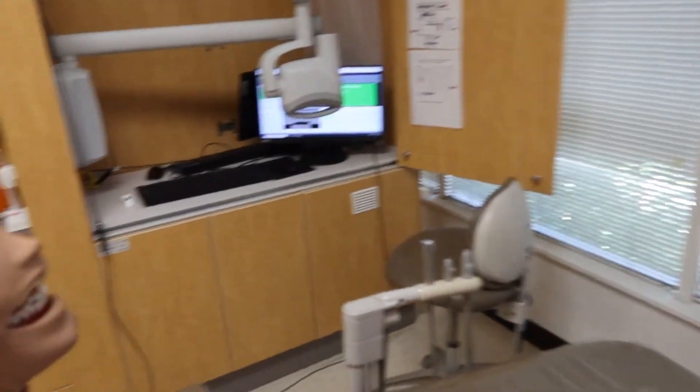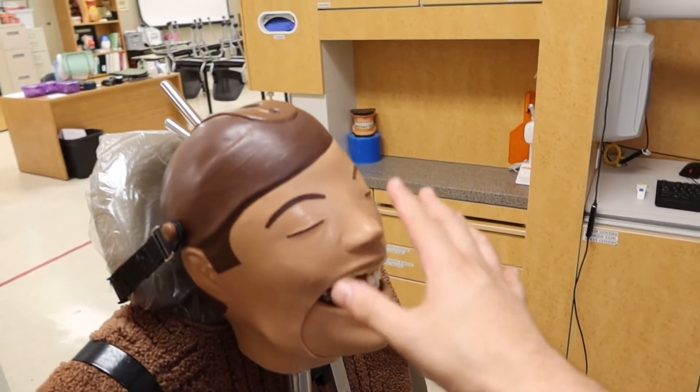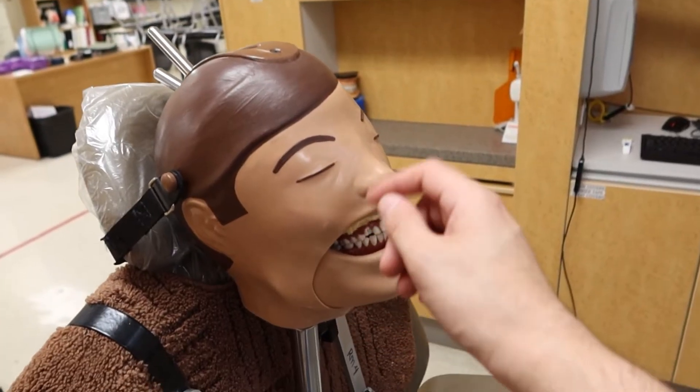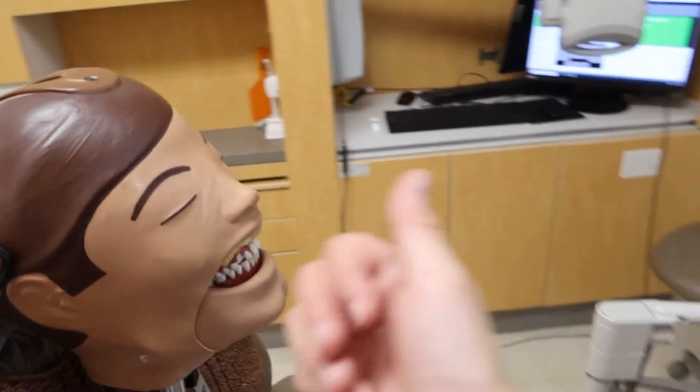Oh hello there Blay, how you doing today? Doing just fine! Awesome. Well today we're gonna take x-rays of your teeth, but first before I get into that let's go ahead and teach you about the x-rays that we're gonna be doing on you today. You're gonna kind of really want to know about that.